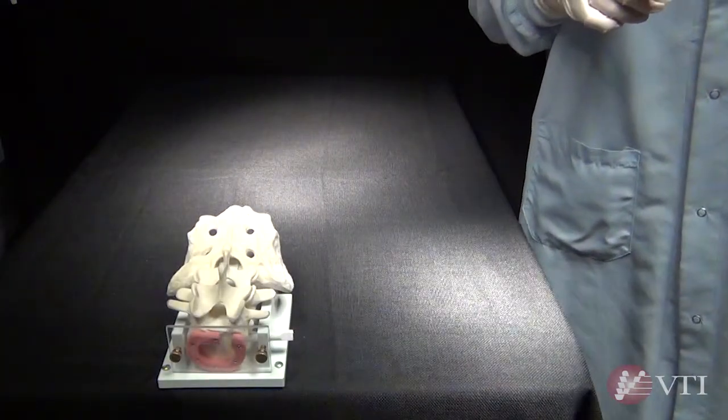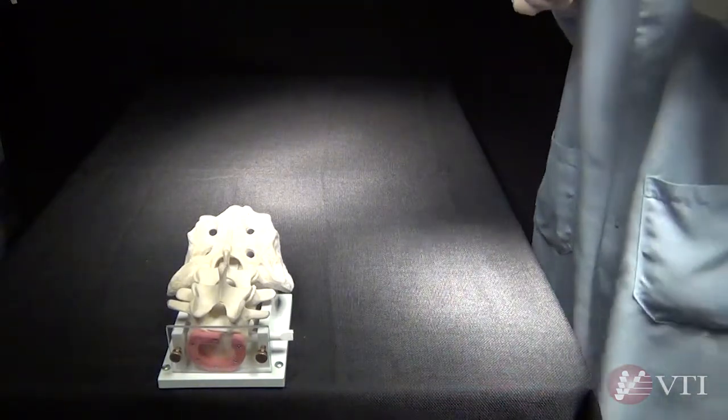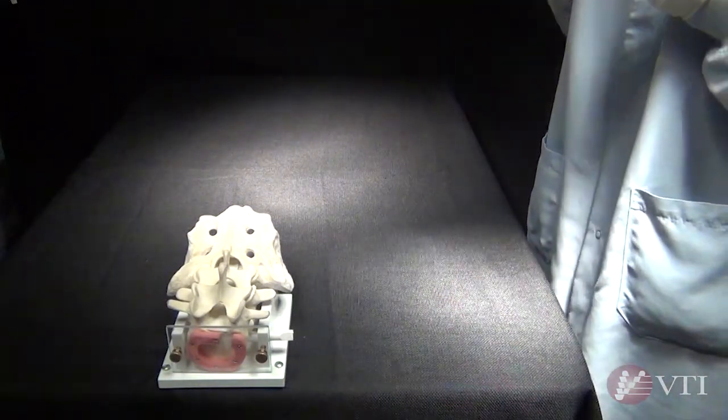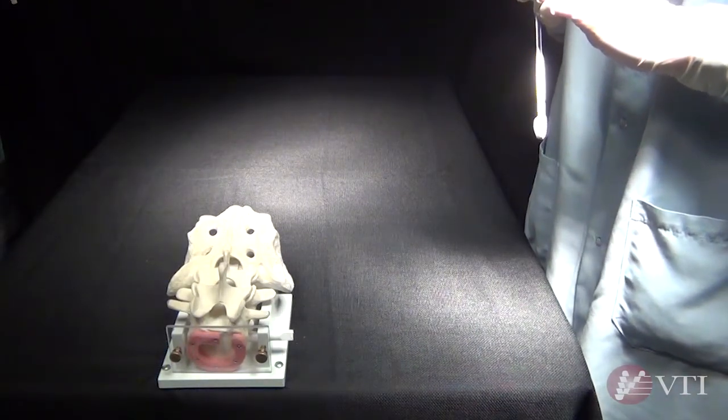Before a segment is inserted, a threaded inserter must be fitted to the posterior threaded hole of the segment until it is flush with the back of the module. Take care not to over-tighten the threaded inserter, especially for the A segment.